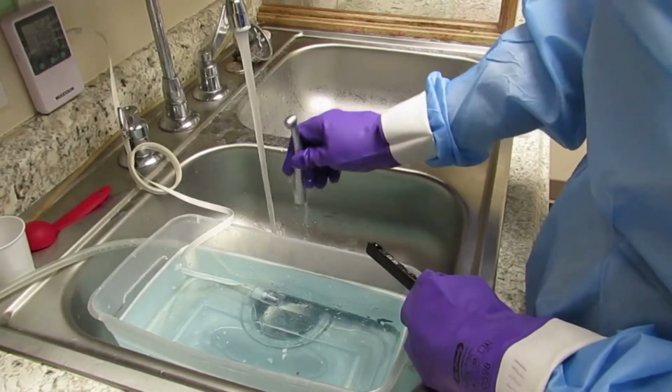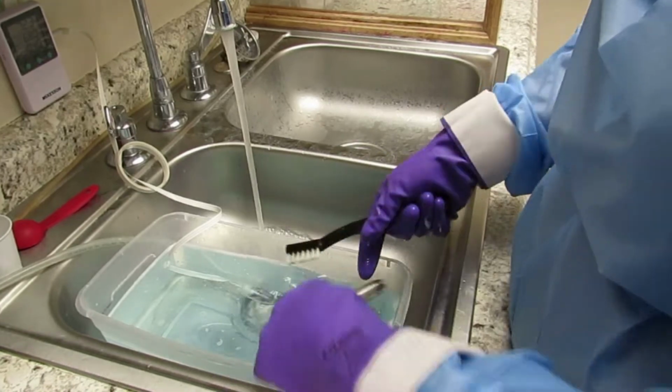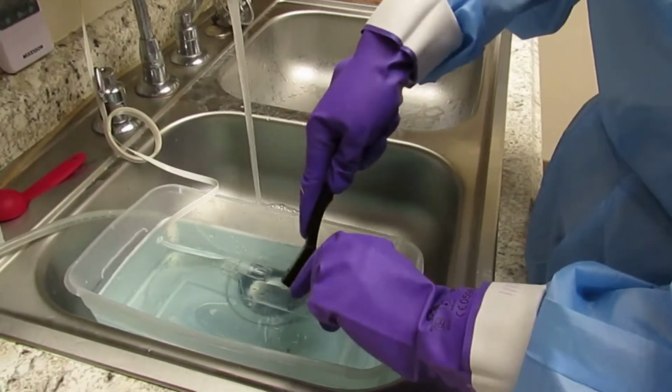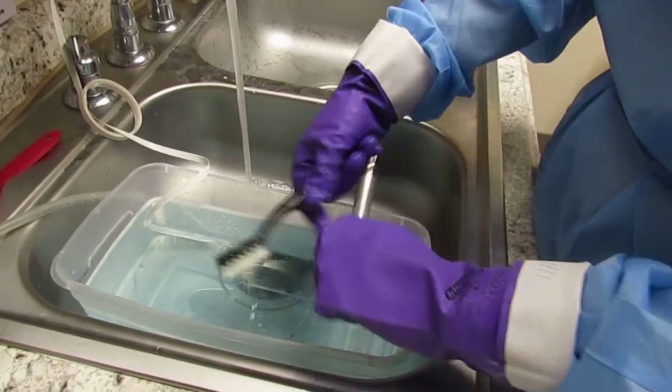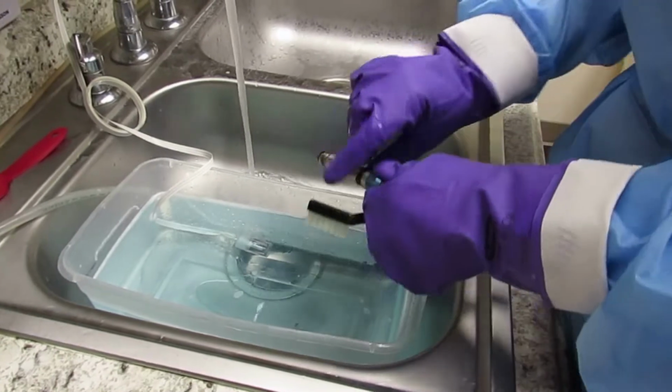When rinsing the detergent off the handpieces, you want to keep them facing upwards to avoid any water entering the connection end, which is the bottom end of the handpiece. When finished, set the handpieces aside.